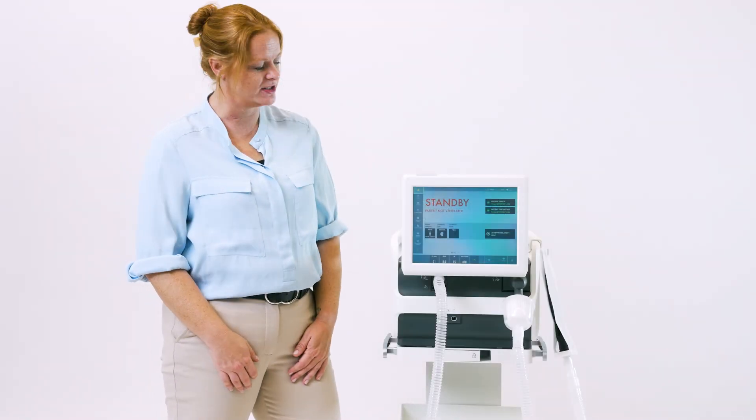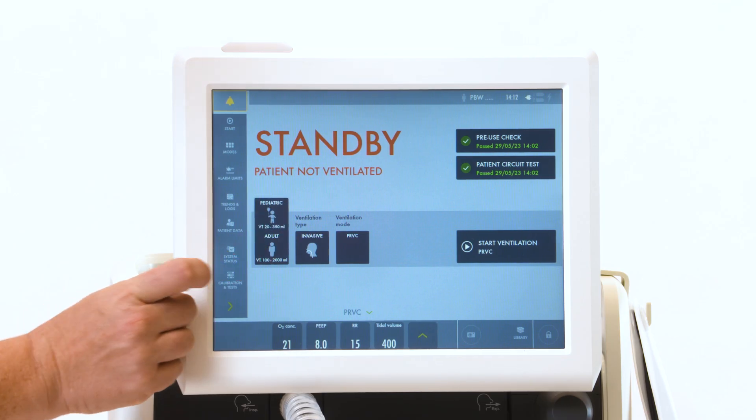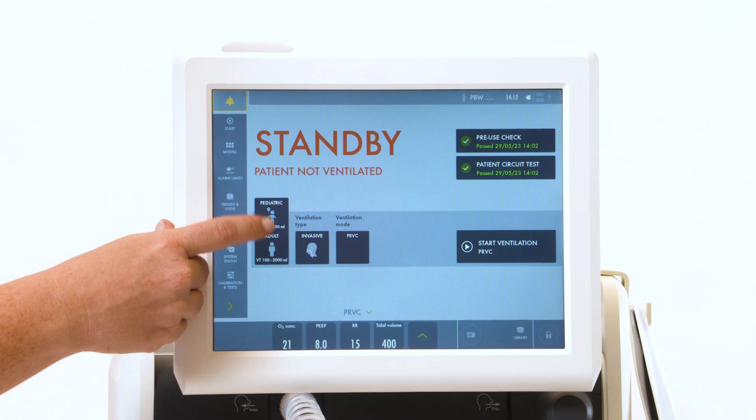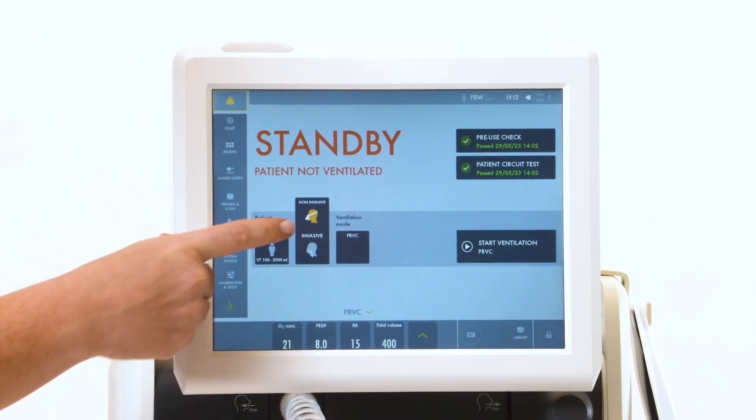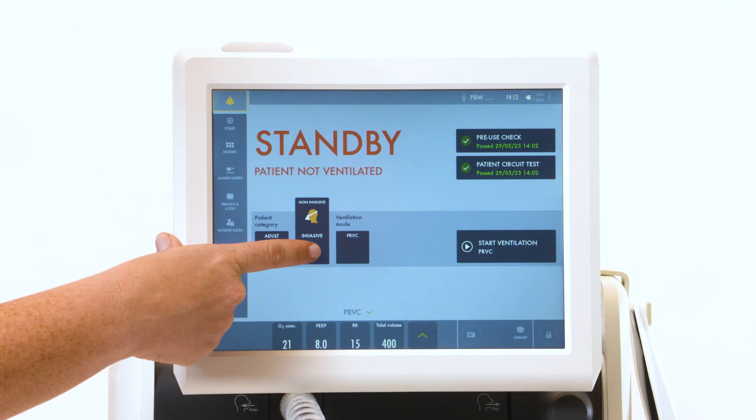Start with the standby screen. Select your patient type, whether they're pediatric or adult, followed by the ventilation type, non-invasive or invasive.